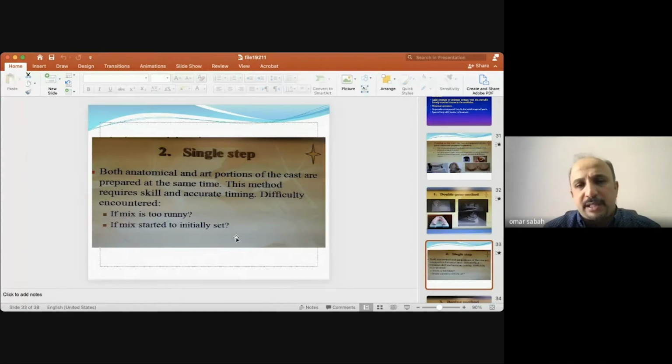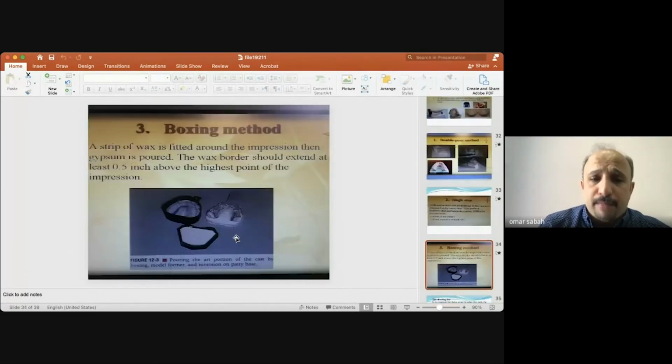I use two steps, which is easier. You can start with the initial setting and be sure of the first stage, and then I can make the base with plaster and so on. So from this point of view, I can get a final result with a base of a different material if you need to save some money.